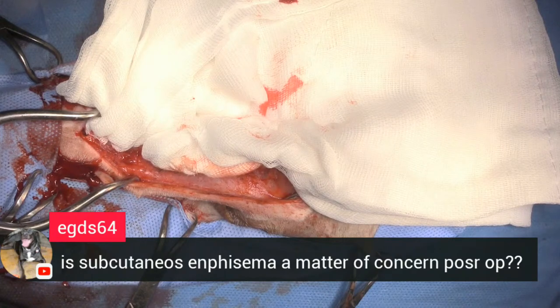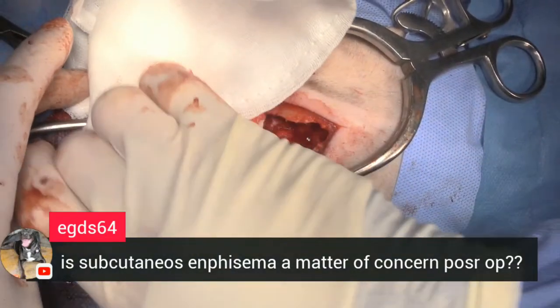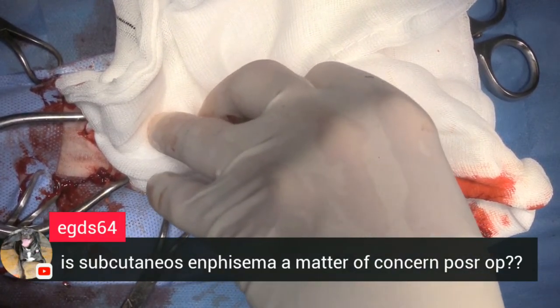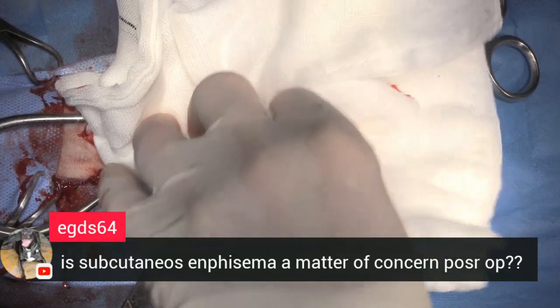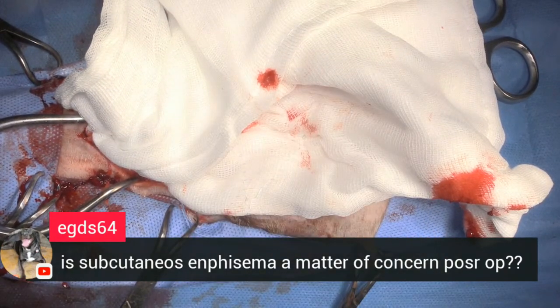There's no issue with fragility of the nose after all this heals. And then we do 5 minute counts in order to allow the blood clot. Blood clotting takes about 5 minutes for the, I think it's intrinsic pathway, including platelet activation, platelet aggregation, and then the blood clot to form a nice fibrinogen to fibrin seal. What's generally thought is about 5 minutes. So we do a couple of those until we're confident that the bleeding has slowed down enough.